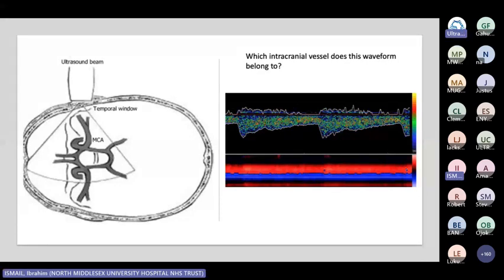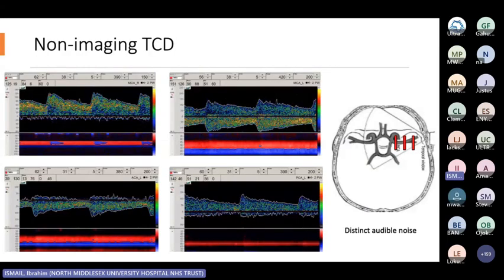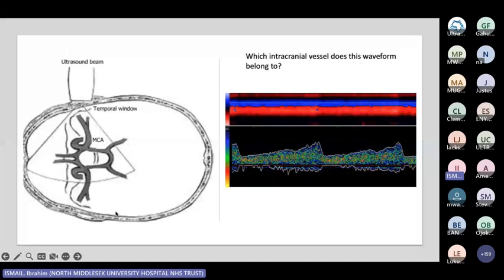I think importantly to note, look at the color scale as well. Exactly. For my colleagues, the color scale was a giveaway to tell us that this was an inverted waveform, having the red and blue alternate, and that was the catch. But yes, it was a tricky one. It was just lighthearted, to see who's paying attention to detail, like we said, Edwin. Attention to detail. As you can see here, that's it.